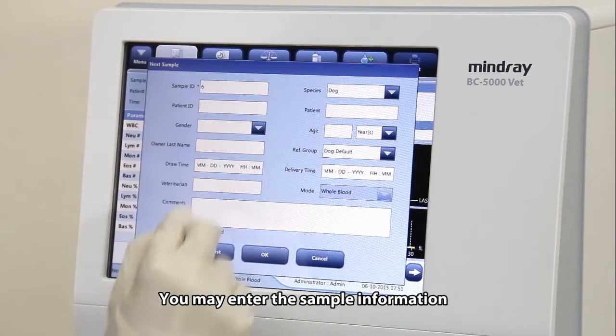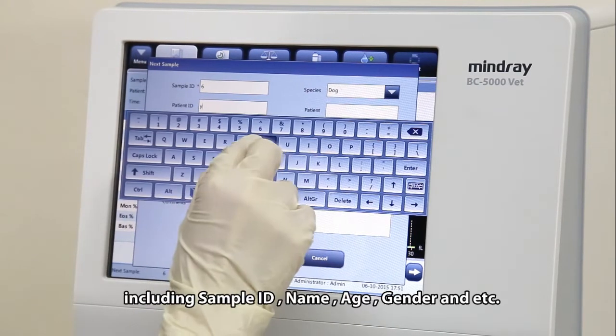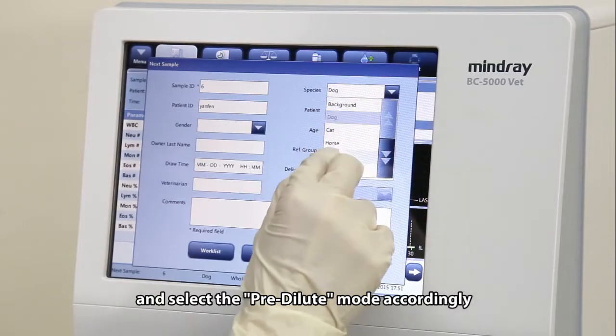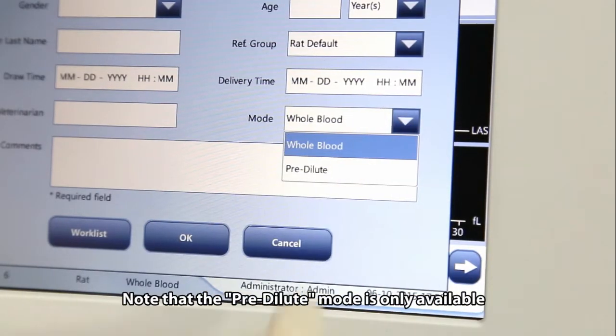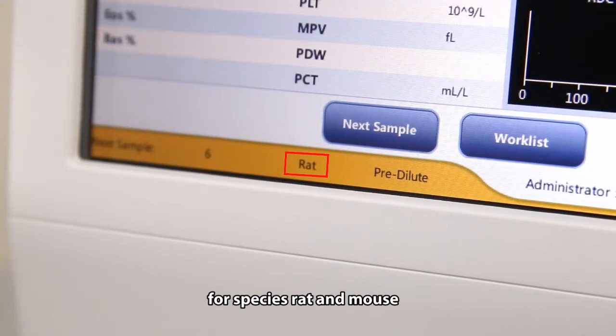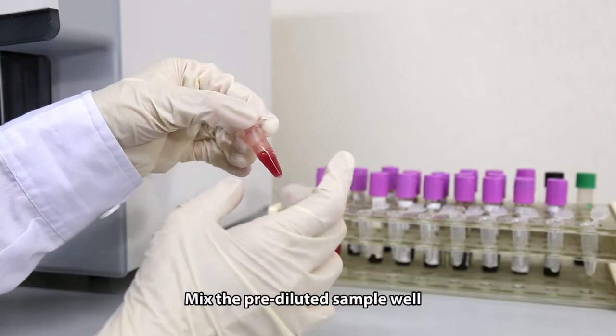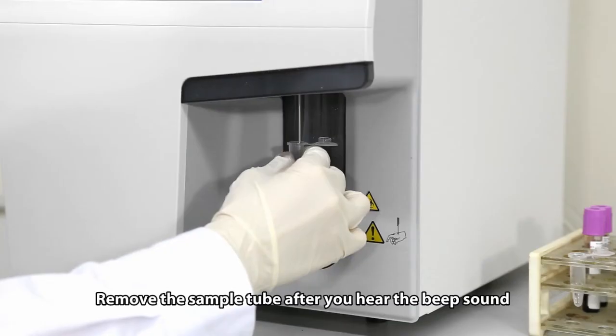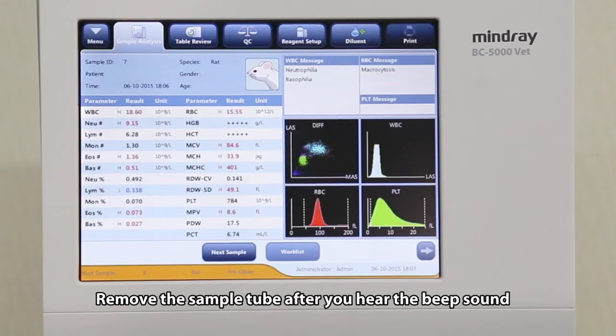Run the pre-diluted sample within 30 minutes after mixing. You may enter the sample information including sample ID, name, age, gender, and more, and select the pre-dilute mode accordingly. Note that the pre-dilute mode is only available for species rat and mouse. Mix the pre-diluted sample well and run it through the sample probe. Remove the sample tube after you hear the beep sound.